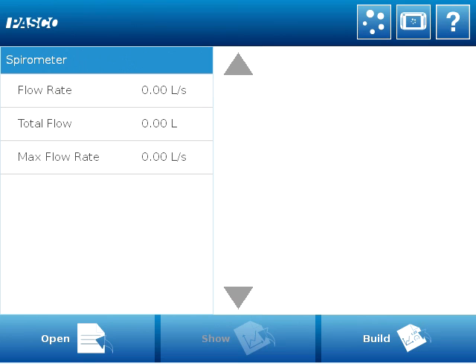Hello! Thank you for tuning in to our video today regarding the spirometer. I'm going to show you how to create a calculation in SparkView so that you can measure the lung volume during your spirometer experiments.